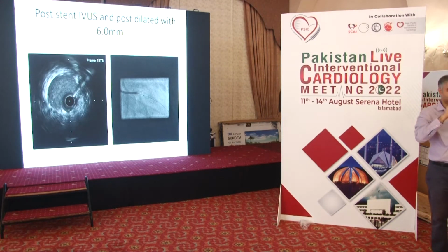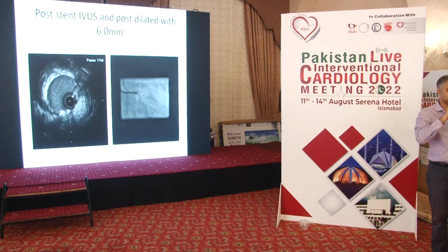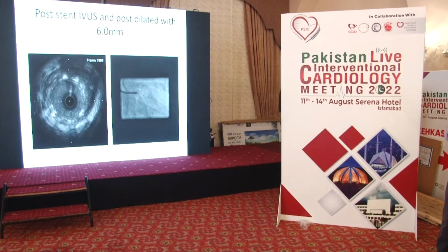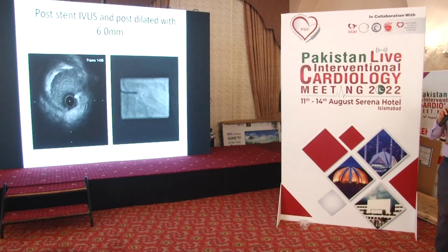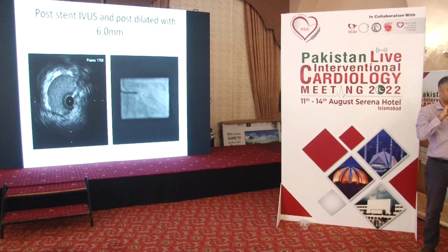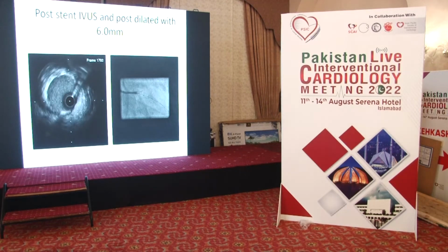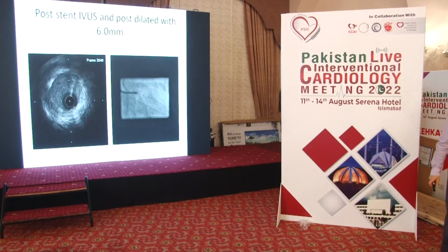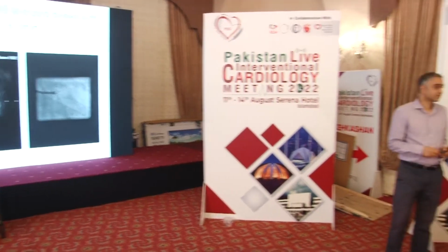Now the very proximal segment here is bigger than that, isn't it? It's around 5.5mm. If you look at the IVUS run, you can see the stent struts, which are evident now. And as we come back into this, you can see that it's abutting the plaque, but it can probably be pushed out further. So what would we call that? I think you were alluding to this. Yeah, I think this is very important. The fact that it's touching the plaque means it's not malapposed, all right?